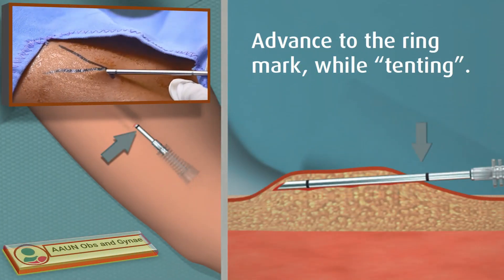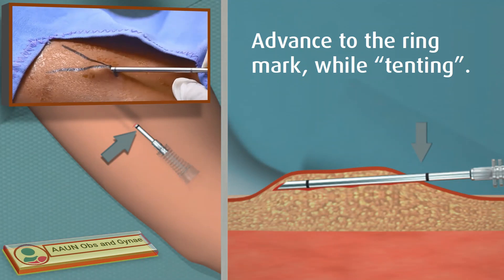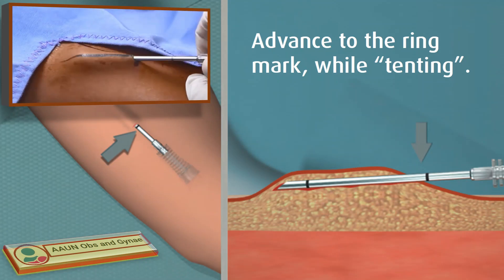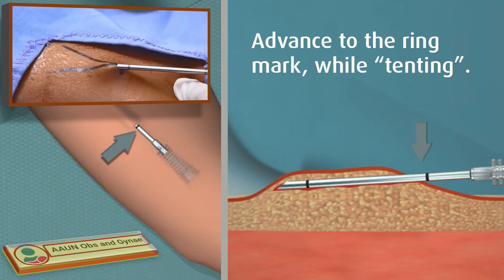When inserting the trocar, avoid touching the part that will go under the skin. Once the tip is beneath the skin, direct it along the skin horizontally by pointing slightly upward, raising the skin or tenting, to keep the implant in the subdermal plane. The trocar should be oriented with the bevel up. It is important to keep the trocar subdermally by tenting the skin, as failure to do so may result in deep placement making removal more difficult.